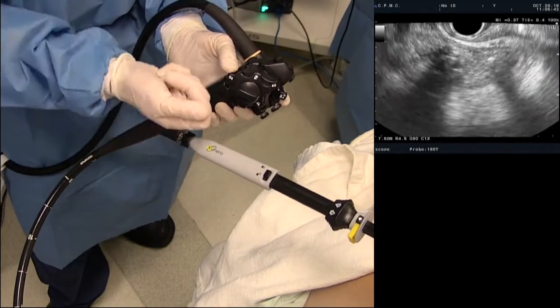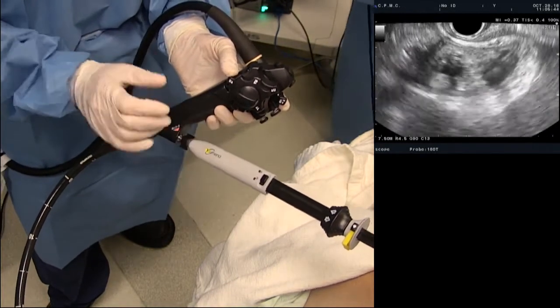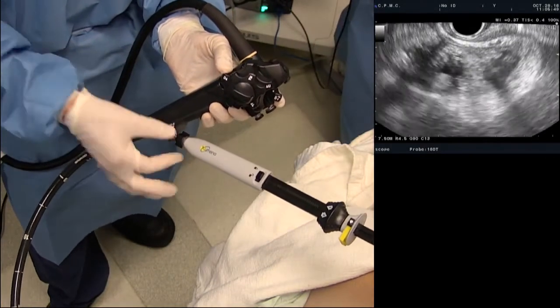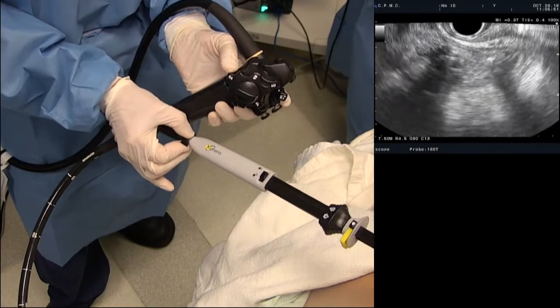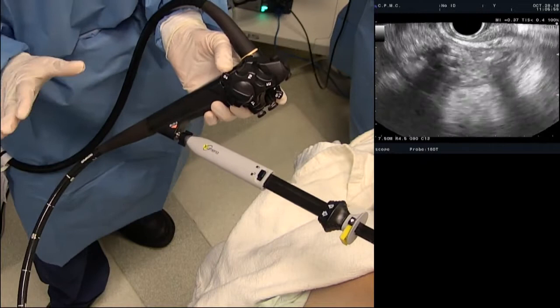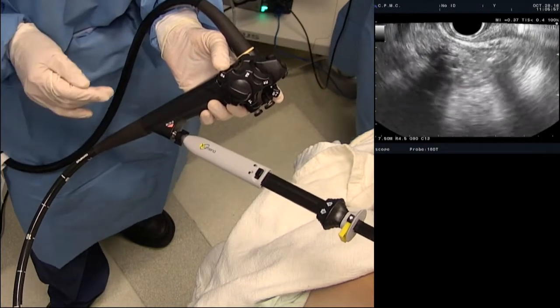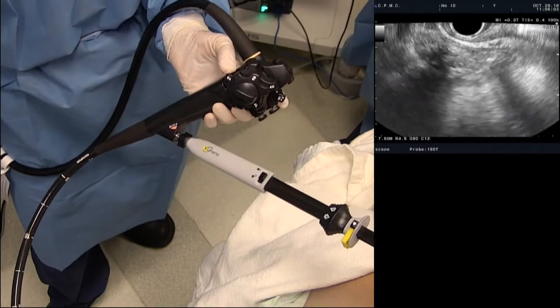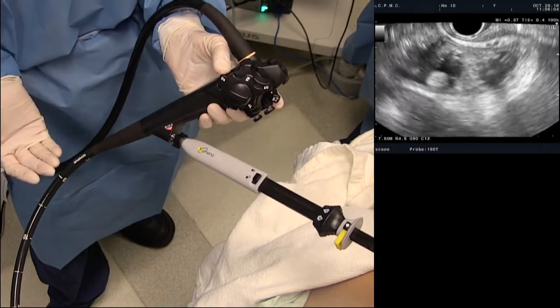We can swivel the catheter towards the operator or whatever orientation you want it to be without loosening the luer lock. All right, so that's swivel luer lock. Now, the first step is the easiest because this is what endosonographers do every day, which is FNA. So this first step is no different than an FNA.